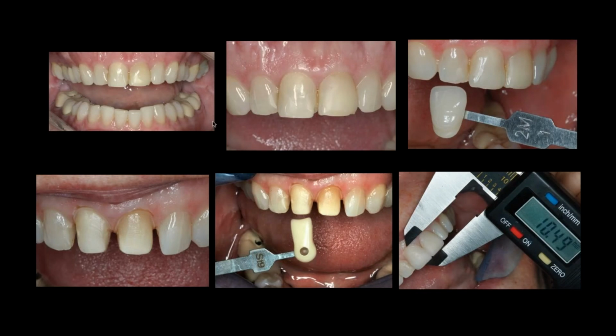Here's another one. The old crowns that are chipped. We take a shade. I take some stains and I paint it on the shade guide to try to reproduce some of these goodies here. Then here you see the preps, and you can see there's two different colors on the preps. I'm not going to worry about that. That's just two. What am I going to do there? Here's a stump shade. We measure the provisionals to get the right length.